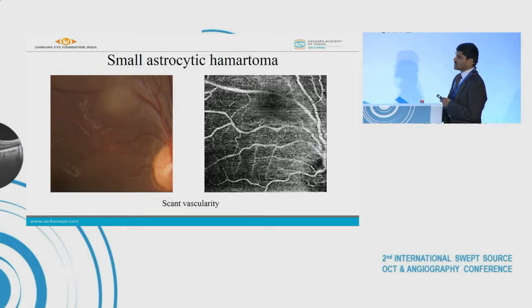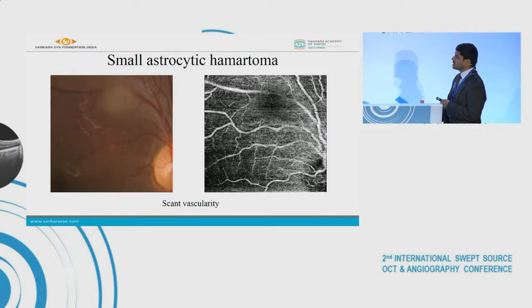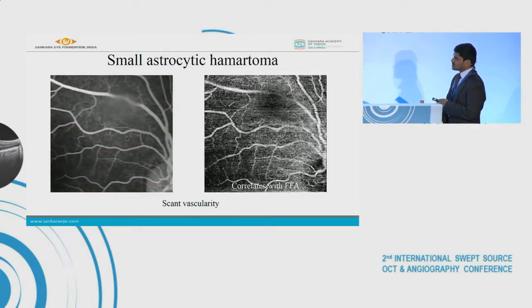It is well known that small astrocytic hamartomas associated with tuberous sclerosis tend to have very low vascularity. This also correlates with fundus fluorescein angiography, where we can see minimal hyperfluorescence in the venous phase. So OCTA correlates with angiography in such cases.